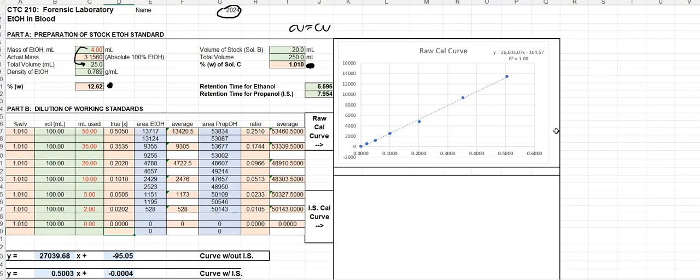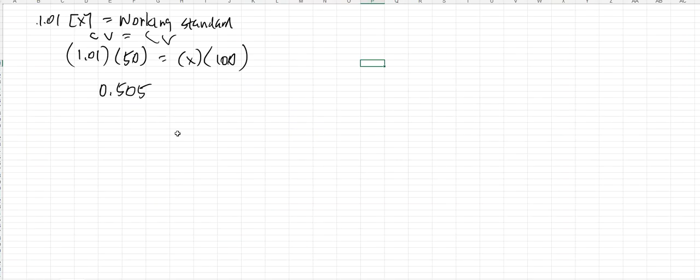All right. So if you've taken other classes before with us, you have maybe been exposed to a calibration curve. What is a calibration curve? How do we handle it? What does it do? To plot a calibration curve, most of the time on the x-axis, it is always the concentration of whatever we are doing.